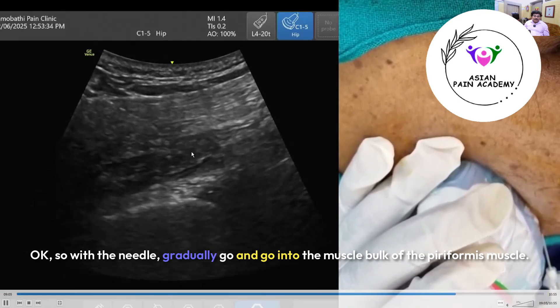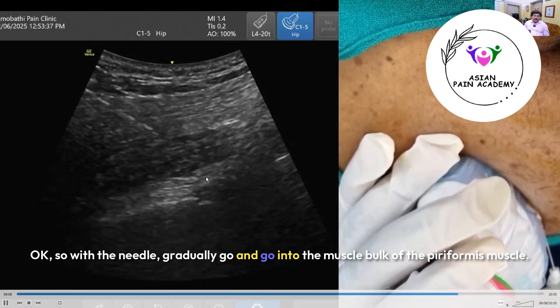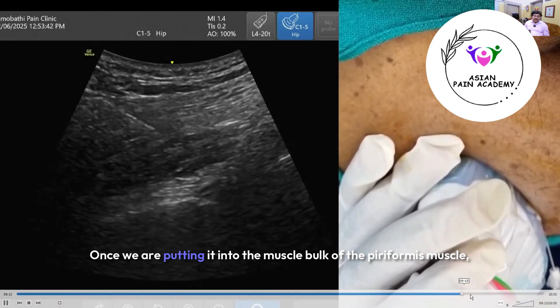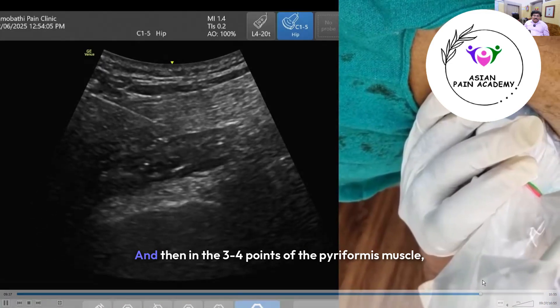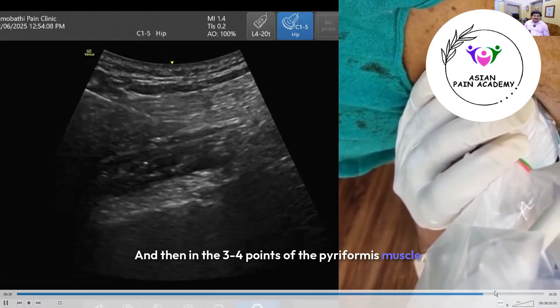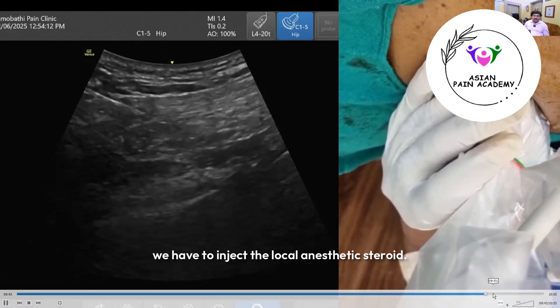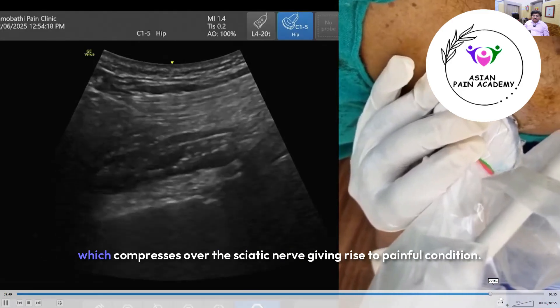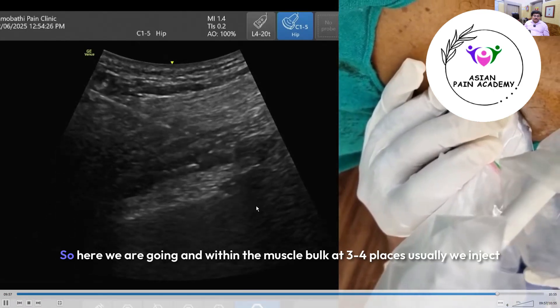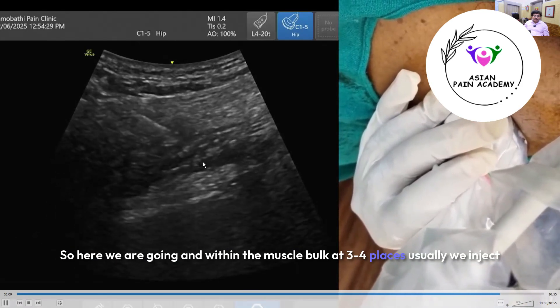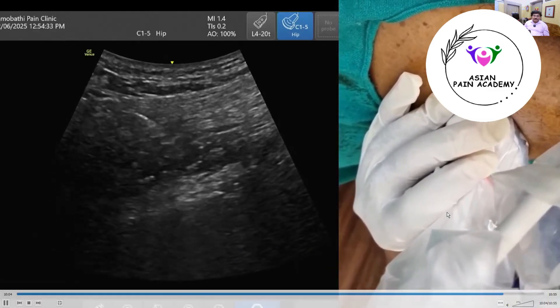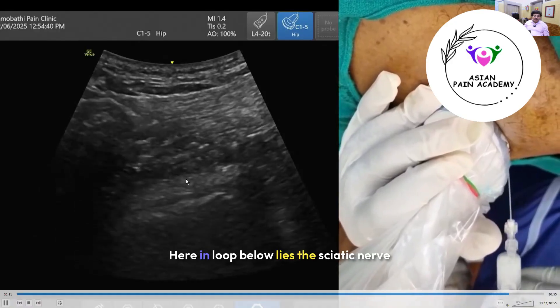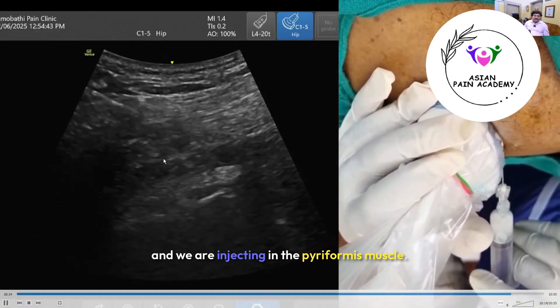With the needle, gradually advance into the muscle bulk of the piriformis muscle — that is very important. Once the needle is within the muscle bulk, at three to four points within the piriformis muscle, inject the local anesthetic and steroid. Remember, there is a taut band formed within this muscle that compresses the sciatic nerve and causes the painful condition. Here you can see the needle tip; below it lies the sciatic nerve, and we are injecting into the piriformis muscle.